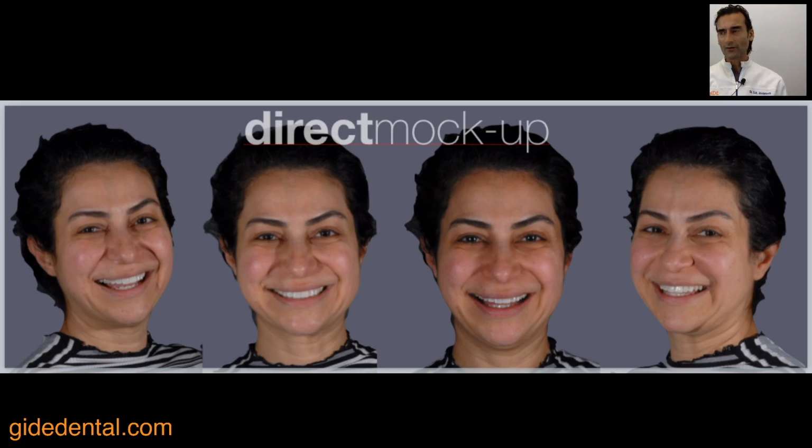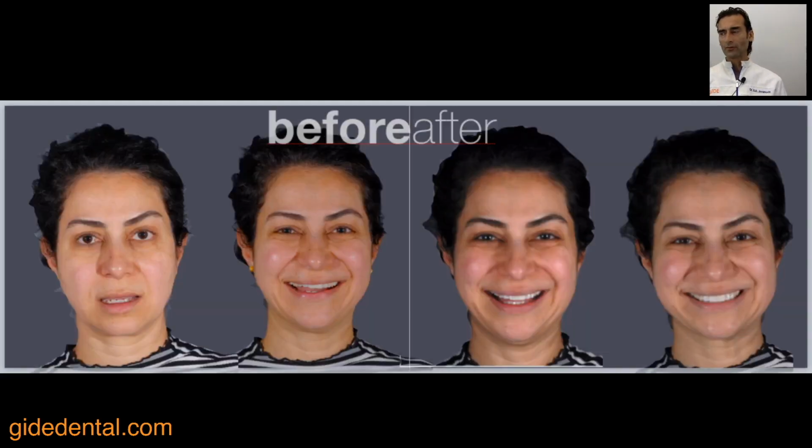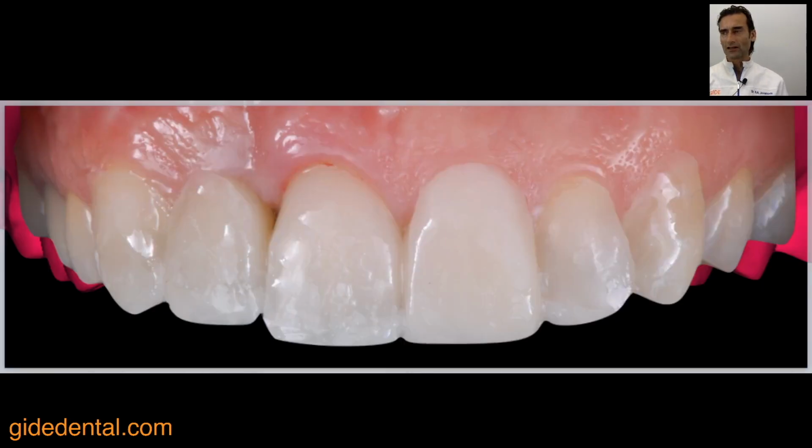And so this is something that, if you compare it to the before and after, it's really a drastic change. And this all is done in one appointment for the patient, just to show the patient the plan that we could do for her to improve this. And here the final improvement, as you can see, really nice to see the improvement in the aesthetics on the number 9. And of course also much better for us when we're thinking about the implant.